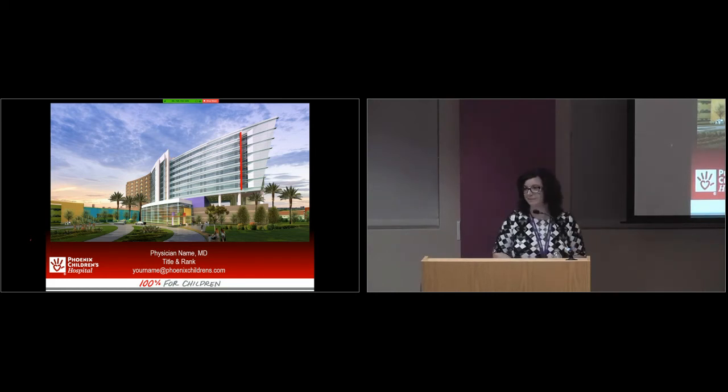Diana? So one of the things that we see in radiology elsewhere, in CT and MR, is we want to power inject lines. So what are the guidelines for choosing when to place a power PICC and a non-power PICC? What we're doing is, in the venous access order, there's an indication of what's going to be infusing through the line. Also, if you have a child that's going to need CT examinations, then we would place a power PICC because we can inject contrast through those lines.